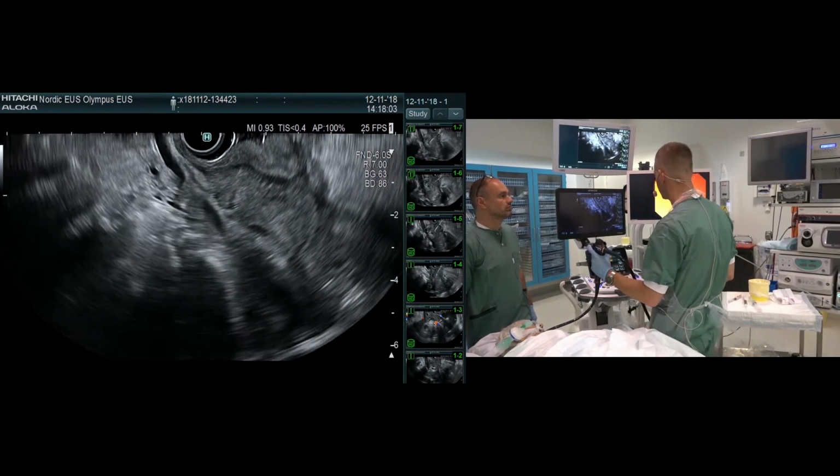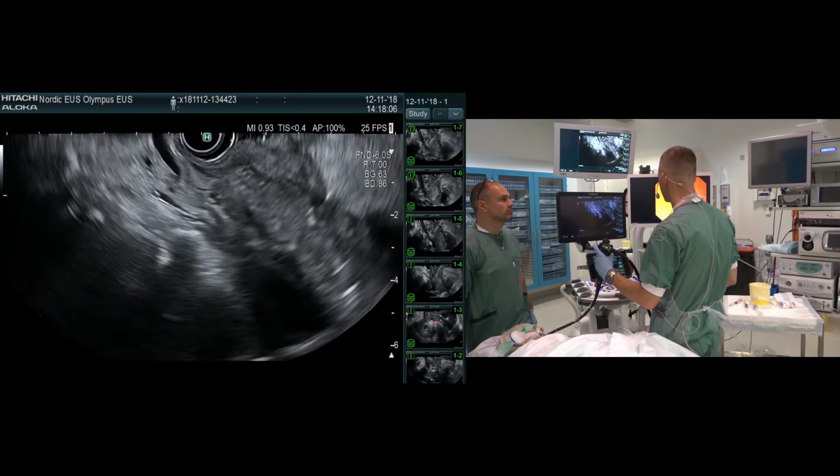Looks like this tumor is a duodenal tumor invading the pancreatic region. So I think that I would agree with Julio that probably there are data nowadays from 2 randomized controlled trials that suggest that choledochoduodenostomy has the same result as compared to ERCP, but is quicker. So probably in this case we are dealing with an 84-year-old patient with also metastatic disease. Probably it would take shorter time to perform the EUS-guided drainage with the same instrument than to go for the ERCP procedure.